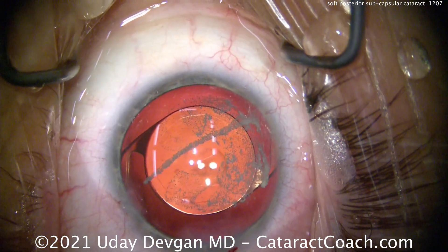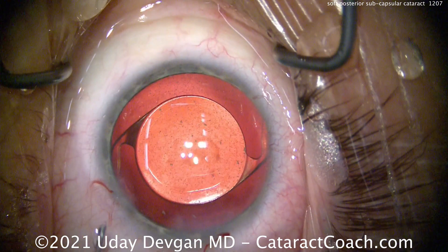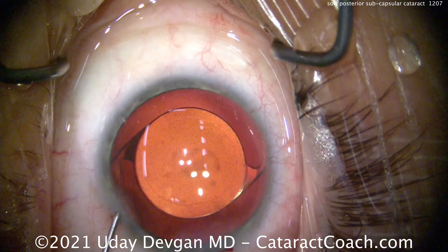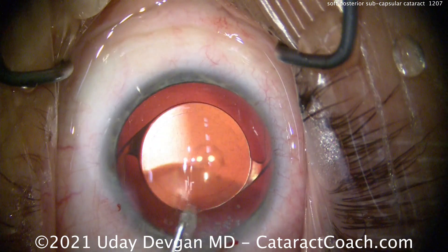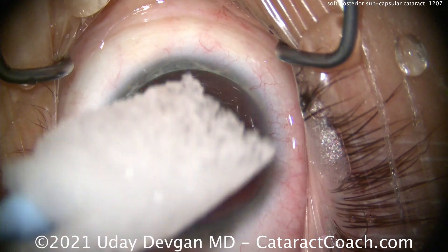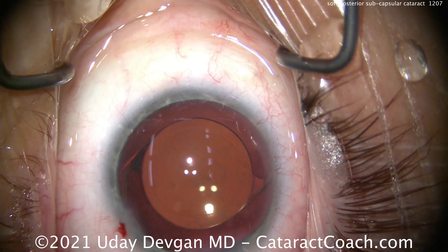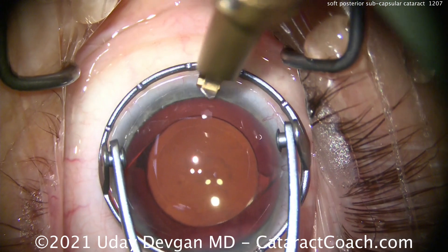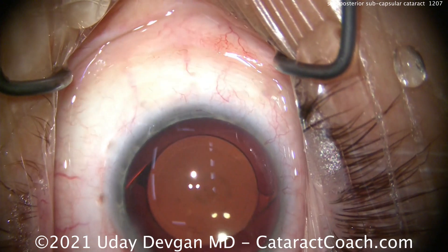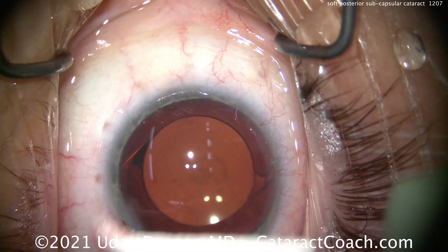Adding triamcinolone, as this younger patient will have more inflammation — it helps a lot. A little BSS to swirl it around, then preservative-free moxifloxacin as our antibiotic. Adjusting the eye pressure and applying tetracaine on a Weck-Cel. Performing a small limbal relaxing incision with the diamond blade to pair with the main incision and treat the against-the-rule astigmatism — a nice little arc. Checking everything for water-tightness at the end: a beautiful outcome and a high level of work for this patient.